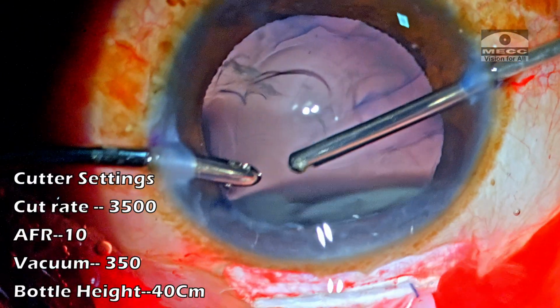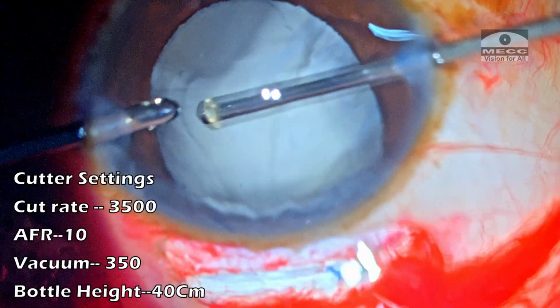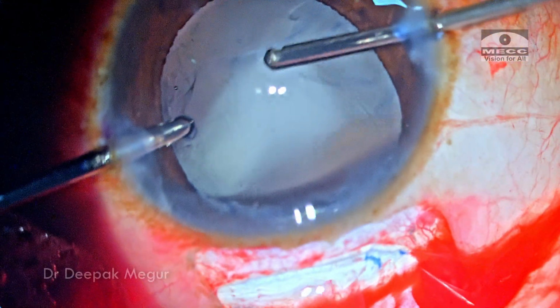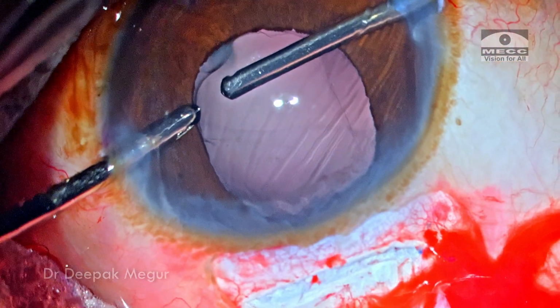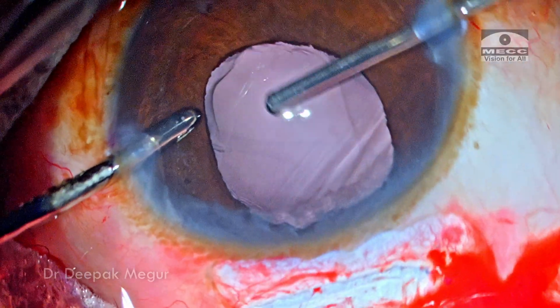These are the settings which I used. Typically, we would want to use a very high cut rate, the highest which the machine can provide, with very low vacuum and flow rate, because this is a peristaltic phaco machine. So in a couple of minutes, the anterior vitreous, which is prolapsed, is taken care of.